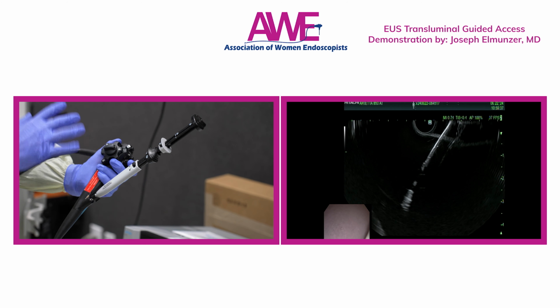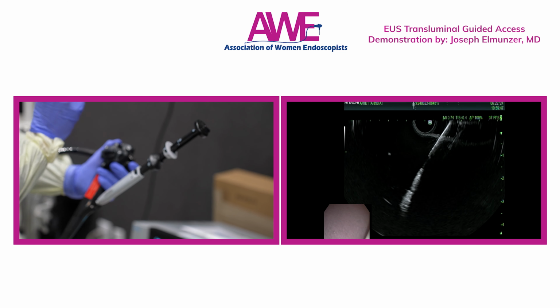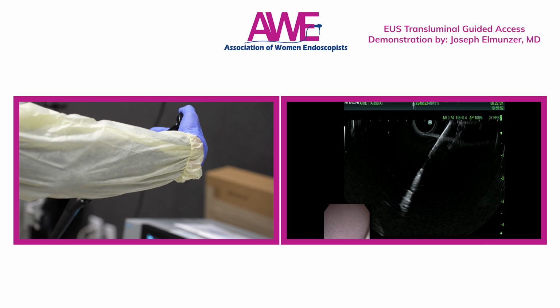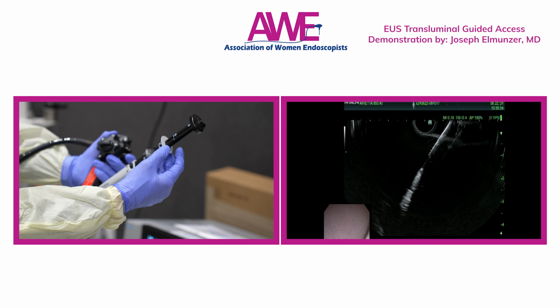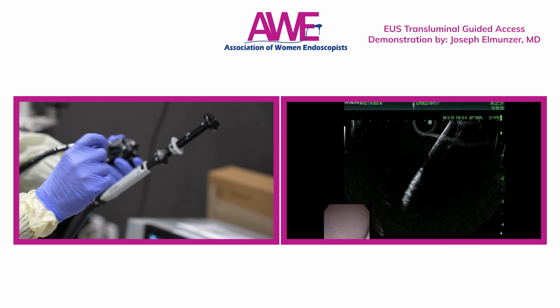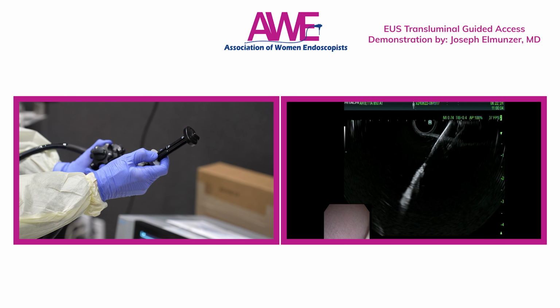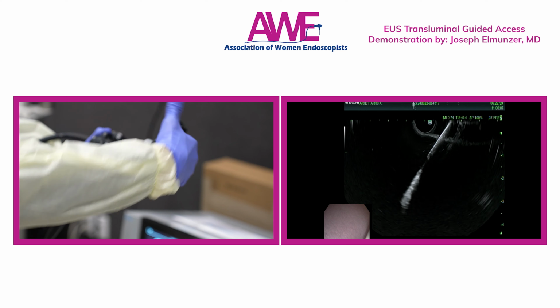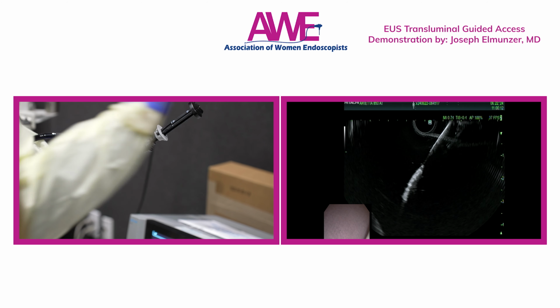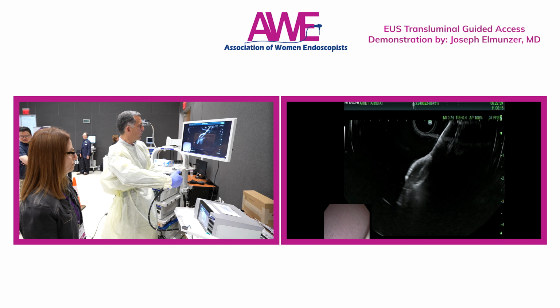Now, one thing worth mentioning if you don't have a lot of working space is that you can actually work in a limited space by milking the tip out and sort of exchanging. The way you do that is as you deploy, you can push the stent deployment hub back toward its original position, and that won't reconstrain it completely. It'll partially reconstrain it. So if you repeat that process, deploy a little bit and then push out, and redeploy a little bit and push out, it allows you to milk it out in such a way that does not send the tip of it really far out. But eventually we will deploy and hopefully see it completely open up.